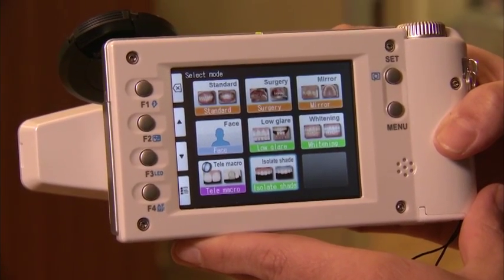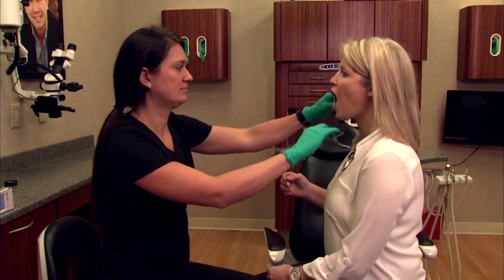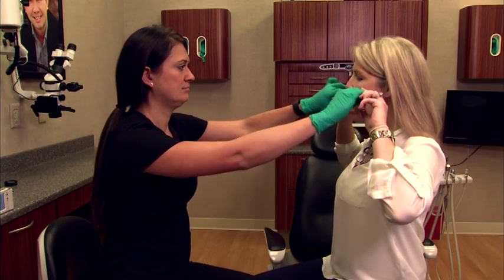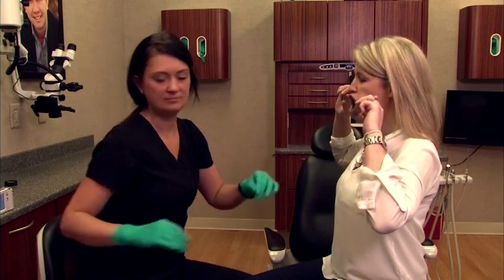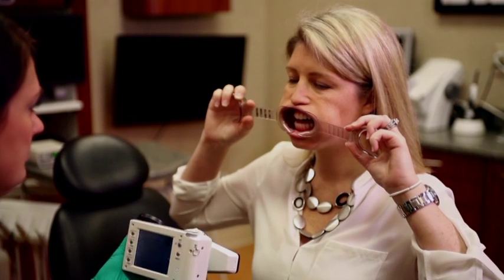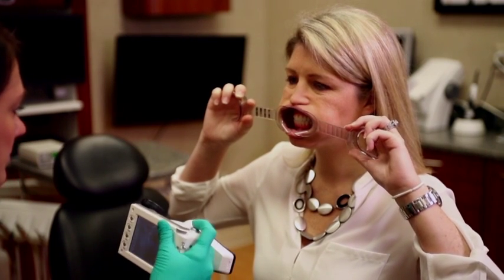We'll demonstrate that a little bit later. The last shots I want to show utilize the camera to take a good picture. There are two settings — the isolate setting or the low glare setting — and you can look at your manual for the specifics. Here I just want to show you how we take the picture.